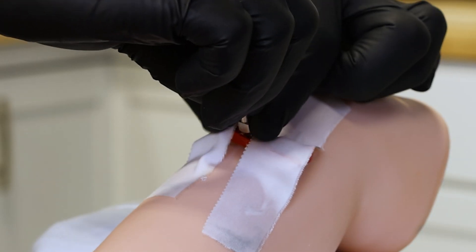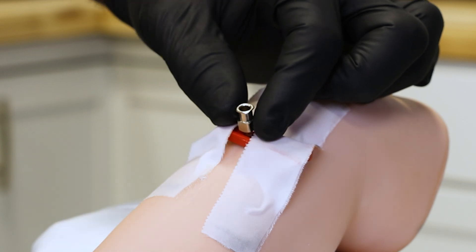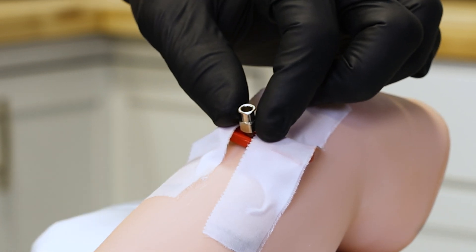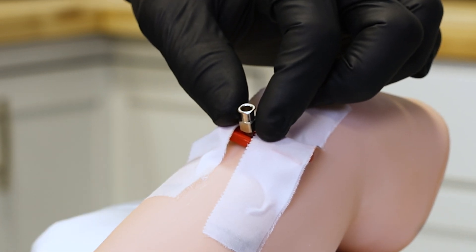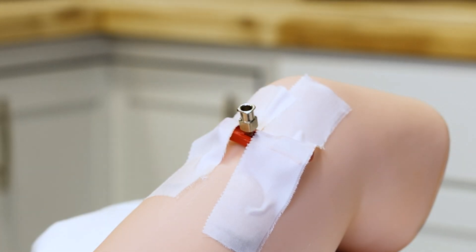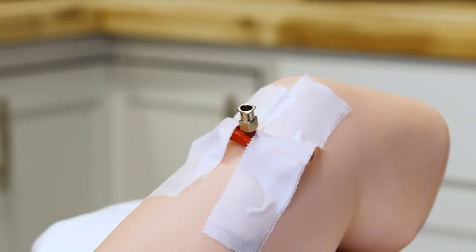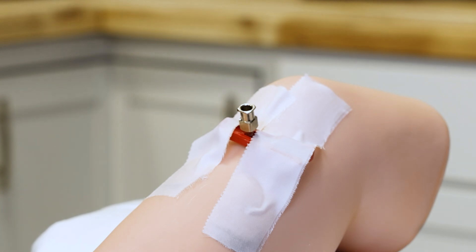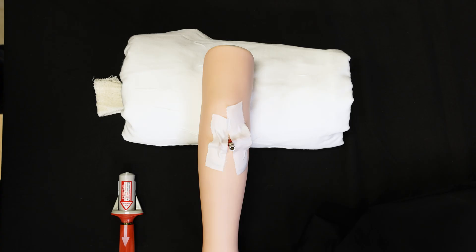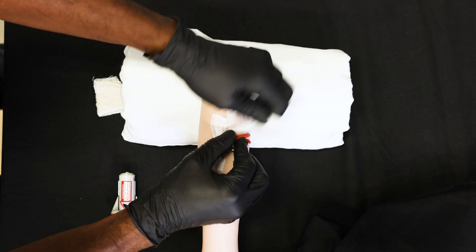Inside the metal needle is the trocar. Remove the trocar with your fingers in a twisting motion. You now have intraosseous access in the tibia using the Big P.